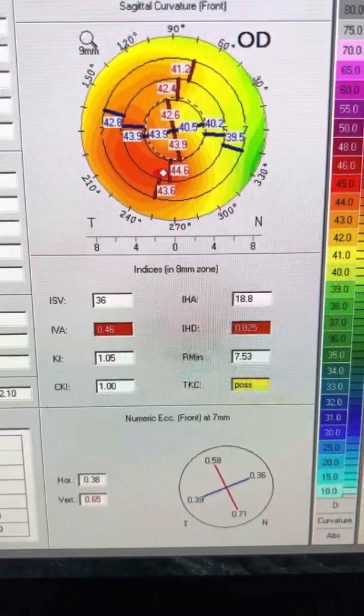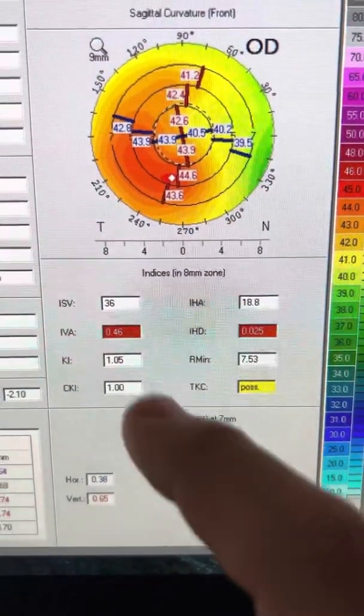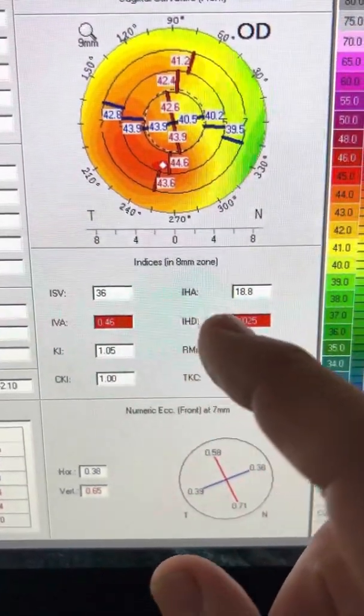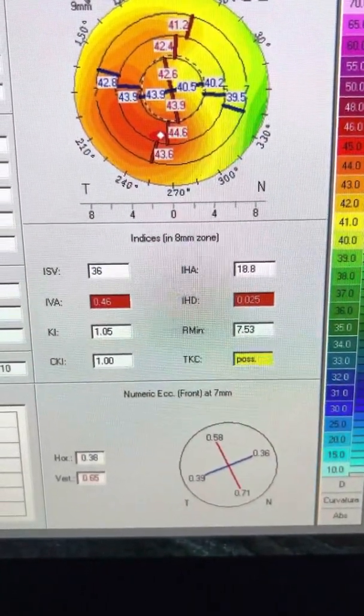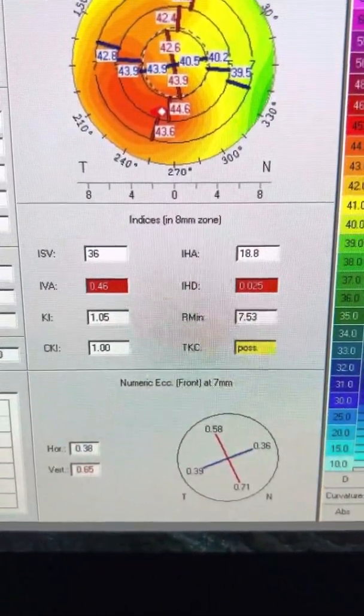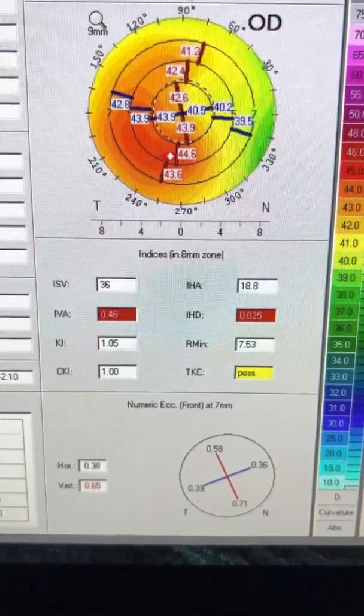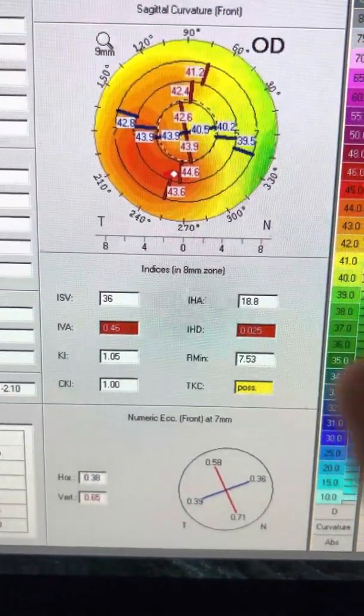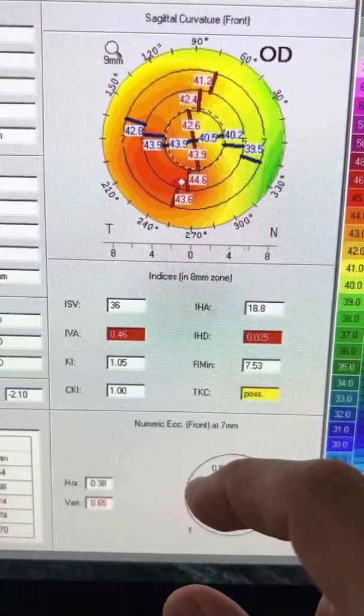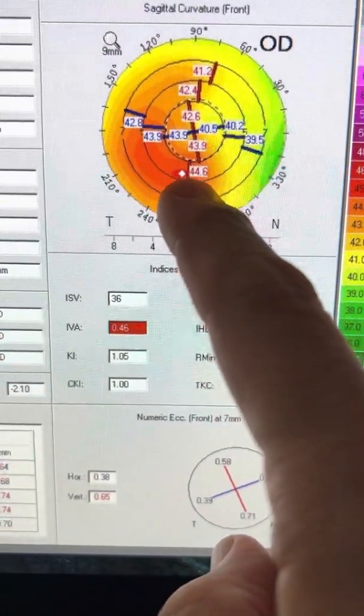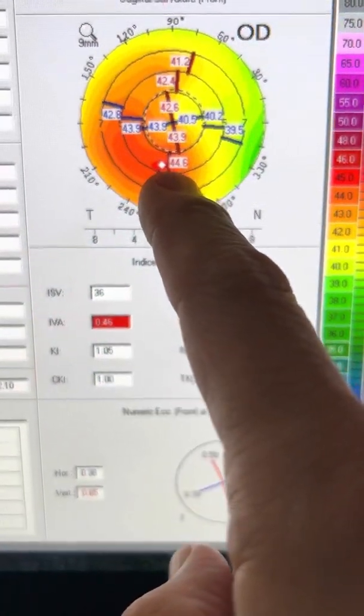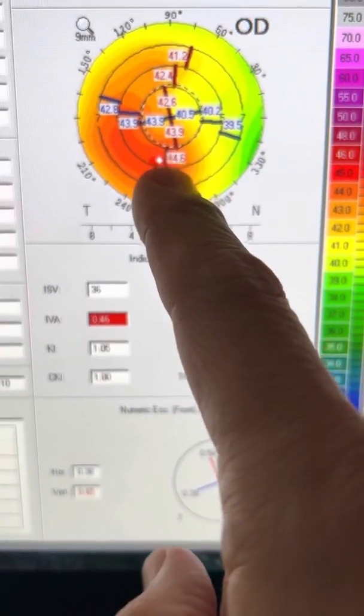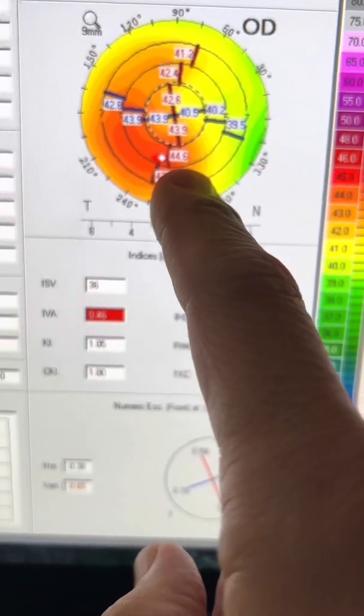And they have changed just a tiny little bit. He, by the way, was born in 92, 30 years old. And we have Pentacams from two years ago. So the steepest part of the cornea has changed just a tad. It was 44.6.